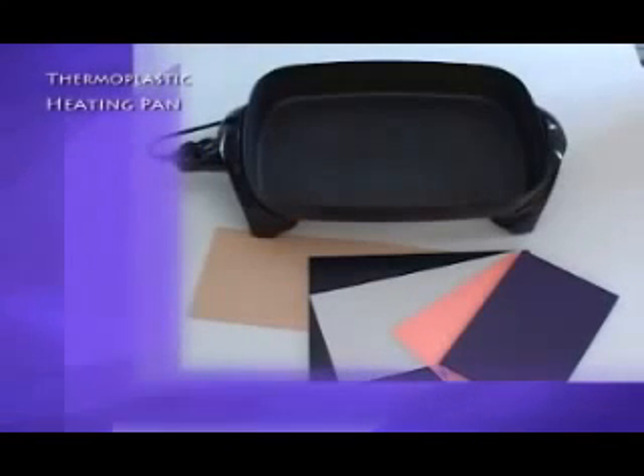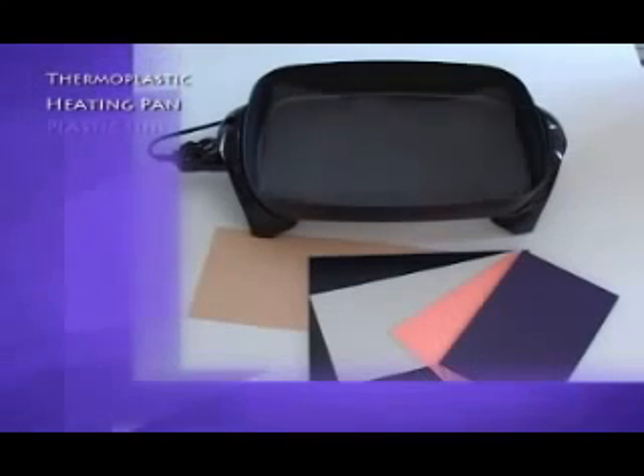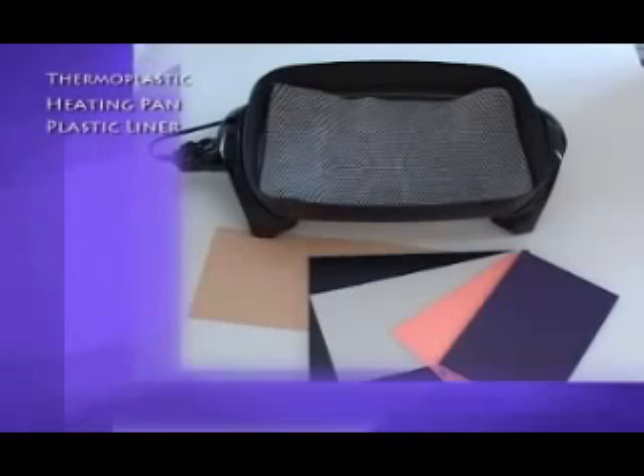An electric heating pan to heat water. Once the water is hot, you can immerse the thermoplastic sheet until it becomes soft and moldable. A plastic pan liner is ideal since it will prevent the thermoplastic from sticking to the bottom of the heating pan.